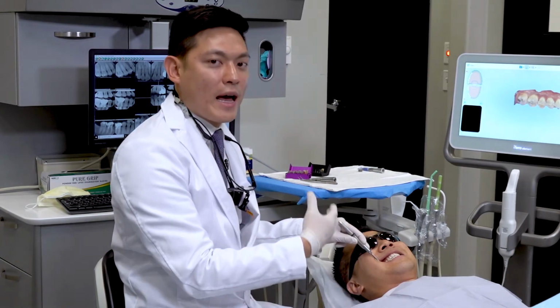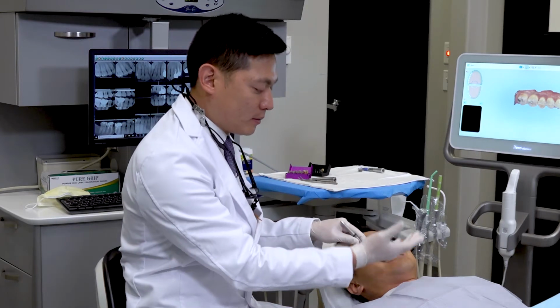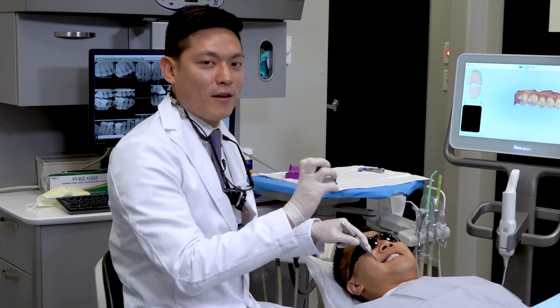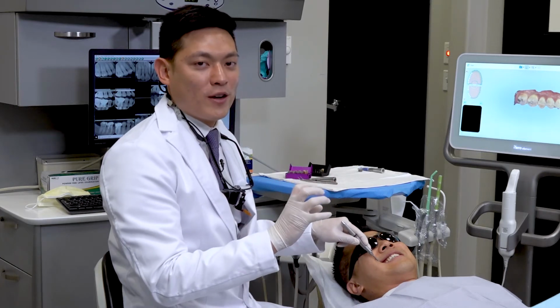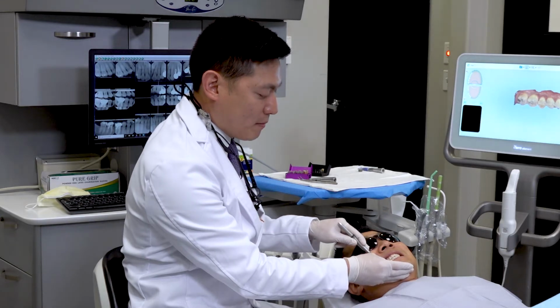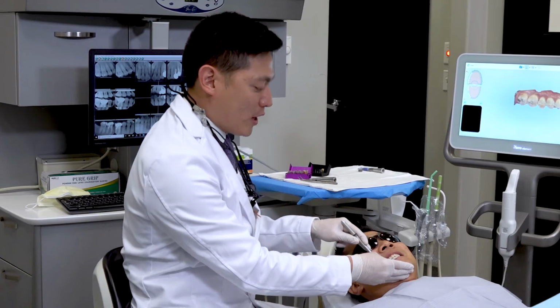Ensure that you can accurately create that position during the scan, because especially if they're anesthetized, that could also impact their sensation of whether or not they're biting together correctly. So it's important that we guide the patient and we capture the scan in that correct position.